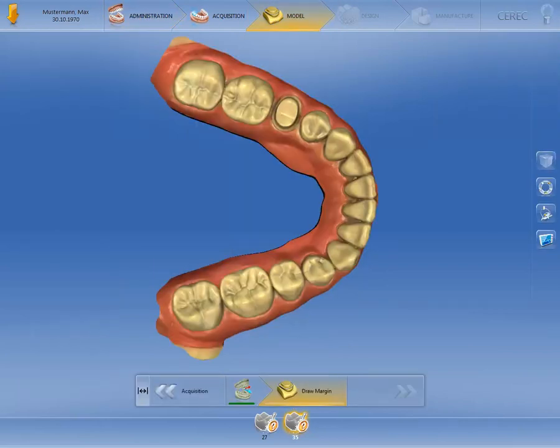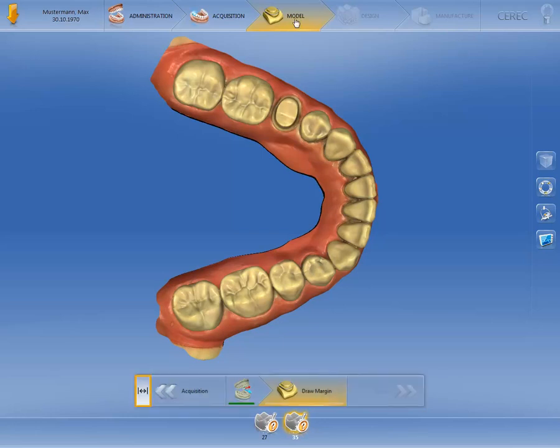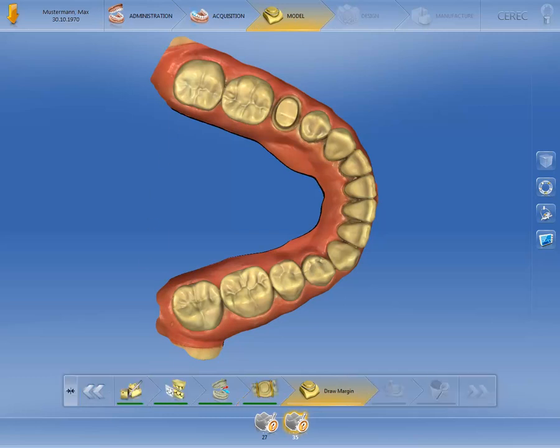Each phase is in turn divided into steps, shown in the step menu at the bottom edge of the screen. The step menu changes depending on the phase in which the restoration is located. You can only see the mandatory steps here by default. Click the button on the left of the step menu to also show and select the optional steps. The last display selected is saved for all future patient cases and restorations.